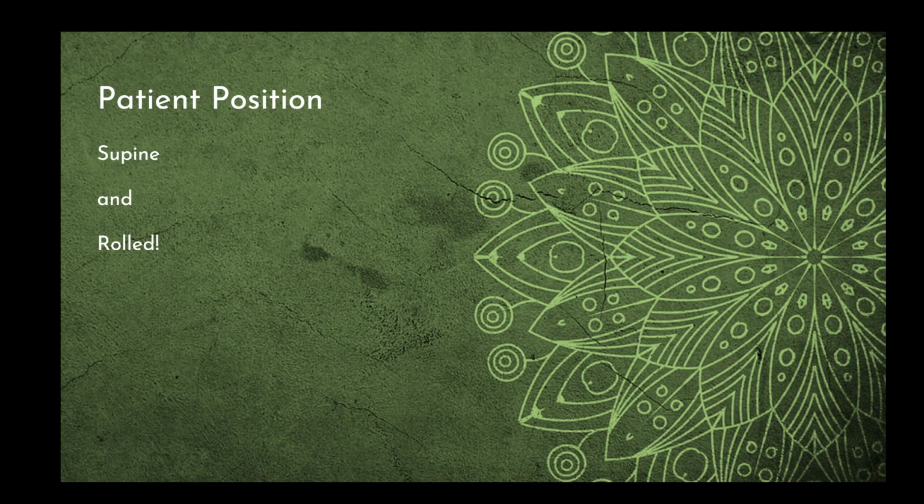So we take pictures in the supine position and in the LLD position. LLD stands for left lateral decubitus. And when you roll your patient, make sure that you are labeling your pictures LLD. We want to show the radiologist that we did that. Now I also like to, once I roll the patient into the LLD position, kind of review the liver. Maybe I can get better pictures of that right lobe with the patient in the LLD position. So it's okay to take extra pictures, just so we make sure that we're seeing all the anatomy clearly.